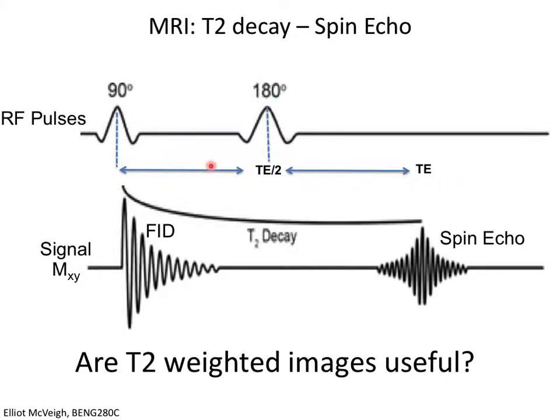We got rid of the spin echo for a while because we were looking at really short imaging acquisition with short TR. And now let's say, well, is there any reason why you want a T2 weighted image? So should we put this spin echo back in for some acquisitions and see what the true T2 value is in that tissue, or what the T2 weighting is? T2 weighted image means long T2 would show up bright and short T2 would show up darker, but the image values themselves are not equivalent to the T2 value. They are just proportional to.